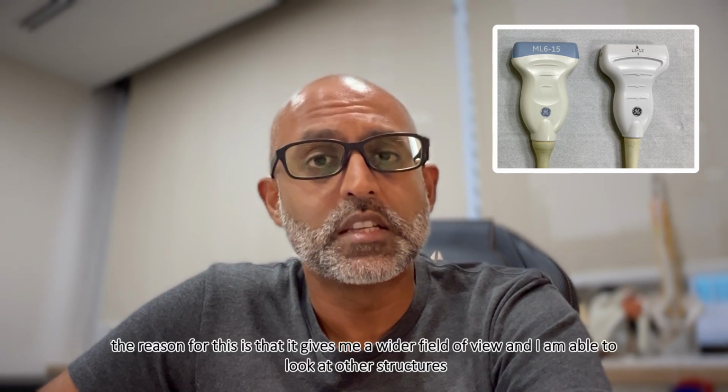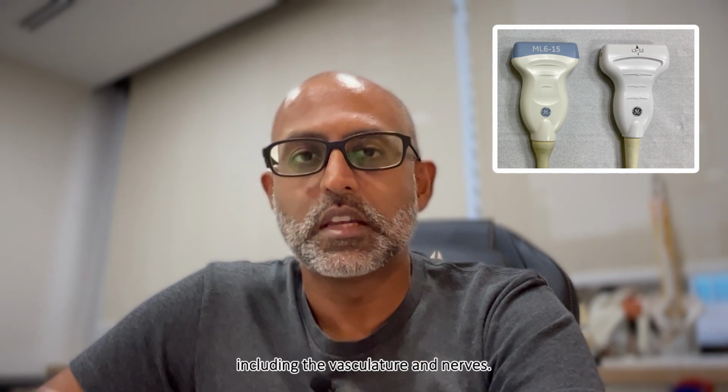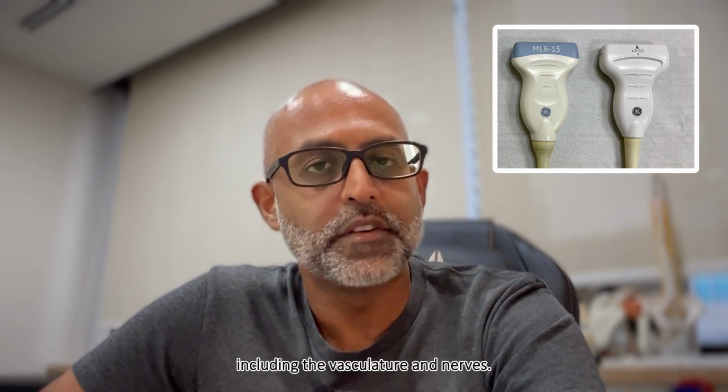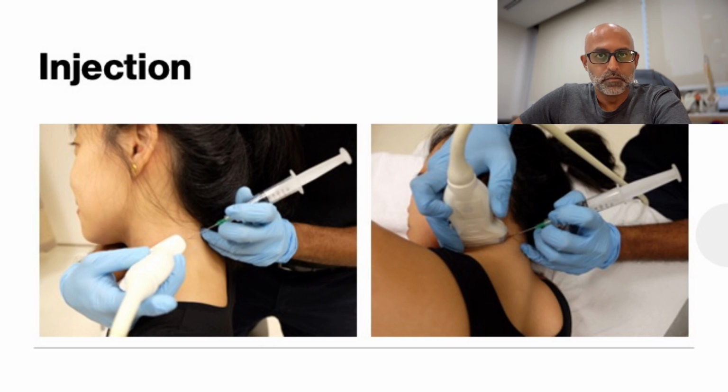The reason for this is that it gives me a wider field of view and I'm able to look at other structures, including the vasculature and nerves. When undertaking the injections, I typically use a 23 gauge needle.